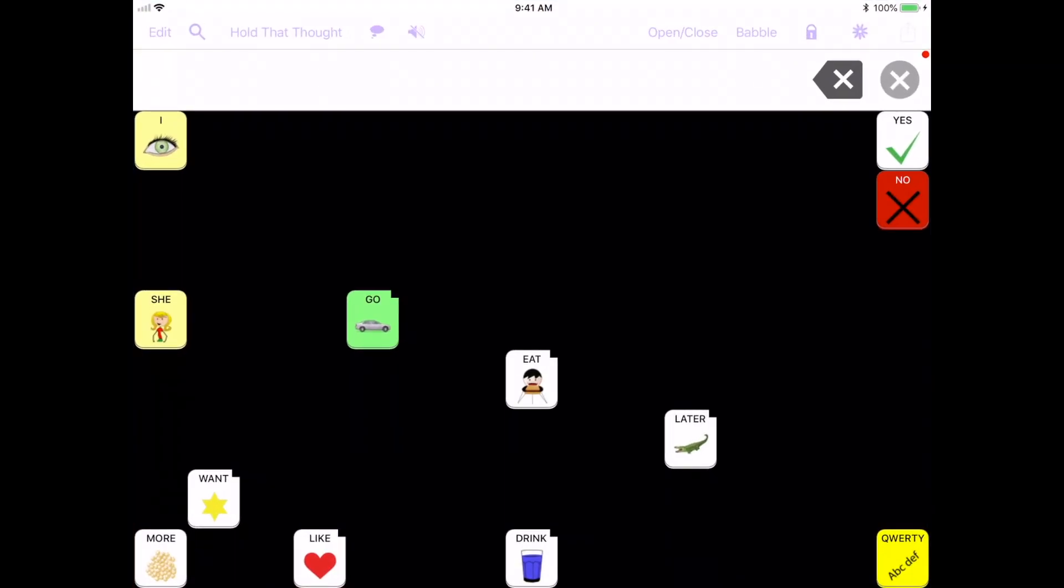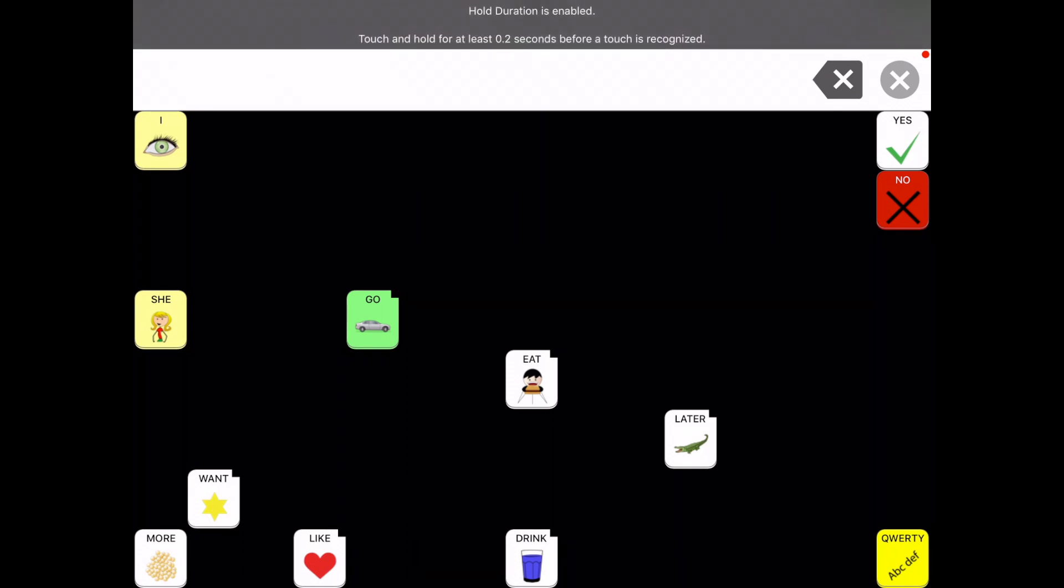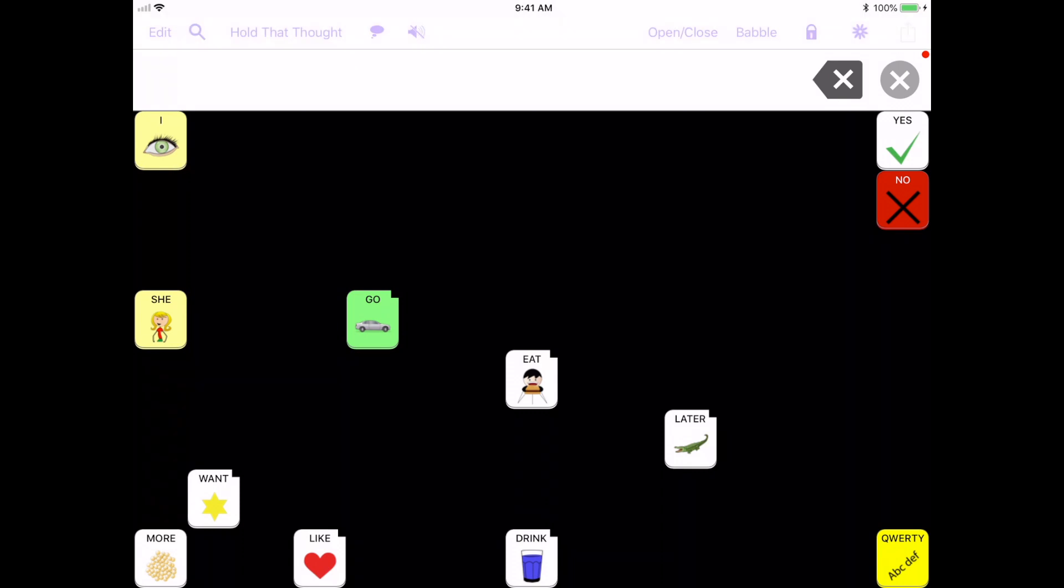Now you see I had to kind of hold that a little bit longer. So one of the things when you go in there and you change the touch accommodations and you change the hold duration, what you're going to also notice is that anything you touch in the iPad you have to hold for that whole duration. So if you want to go into an app, if you want to select a song on YouTube you're going to have to do that. So now when I go in here and I touch eat really fast it doesn't happen. It doesn't activate that button, so I'm going to do it fast a lot of times and watch at the top. You see it says touch and hold for at least 0.2 seconds before a touch is recognized.